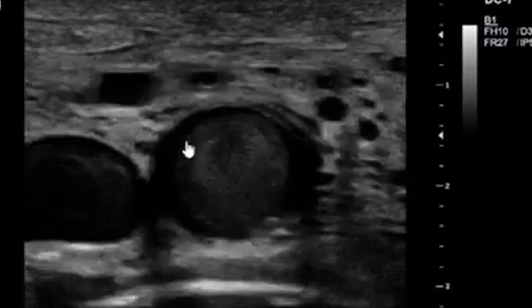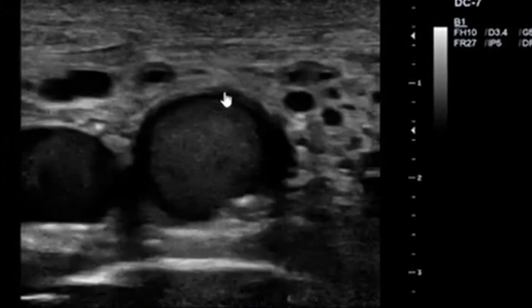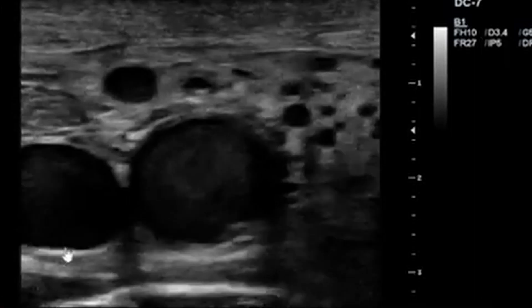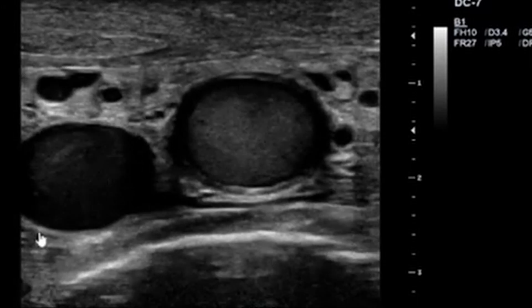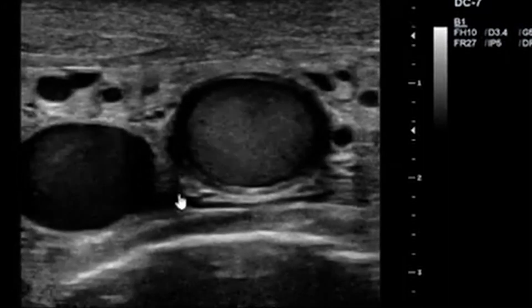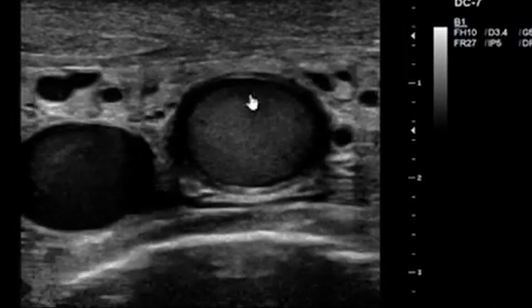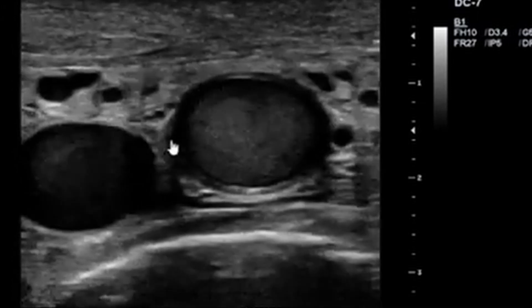Rouleaux formation does not necessarily mean that there is DVT or clotting taking place, but it might actually lead to formation of clots in the vessels. Again, the same phenomenon — you can see thick echogenic blood here, in keeping with Rouleaux formation. You can appreciate the echogenic appearance and the turbulence flow taking place.